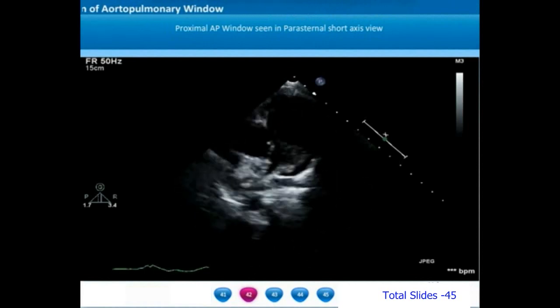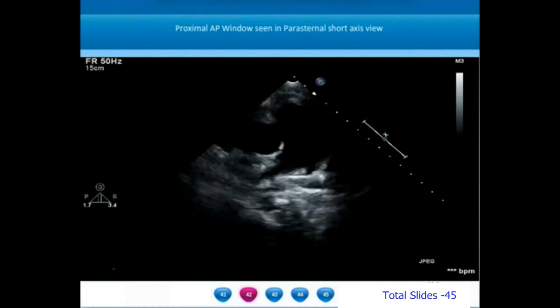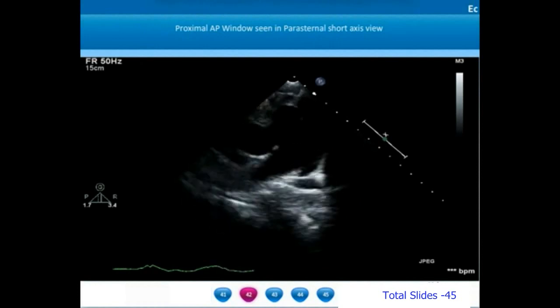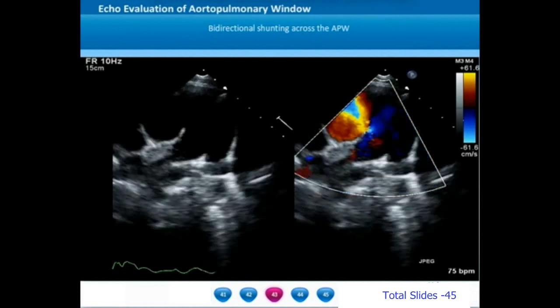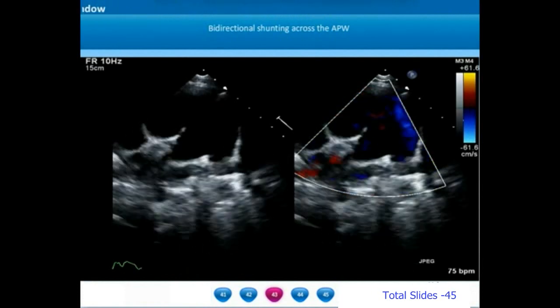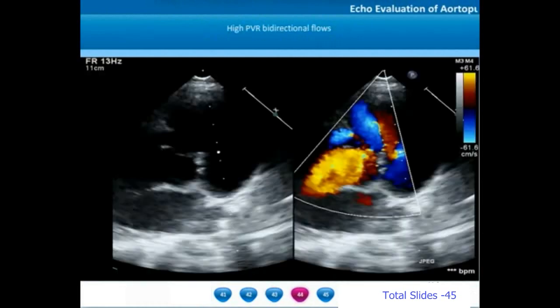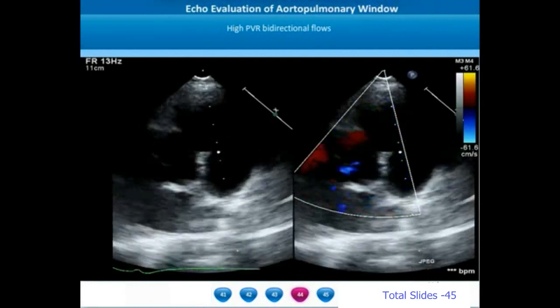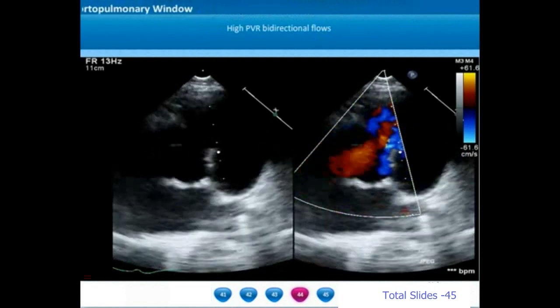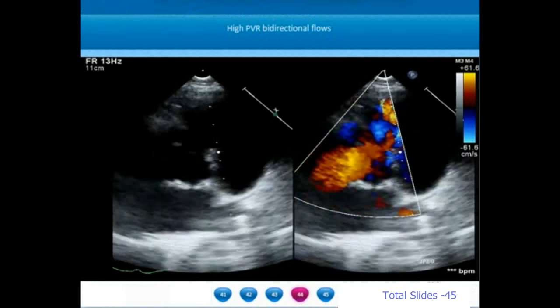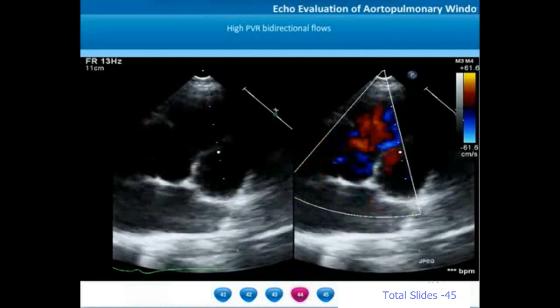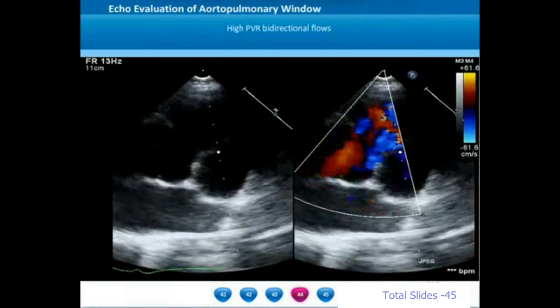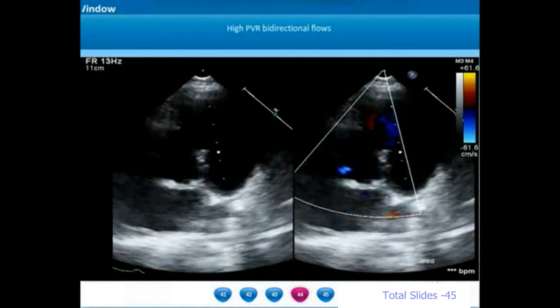However, when we go to a parasternal short axis view, there is a very large proximal AP window not extending up to the PA bifurcation. The aortopulmonary window has almost the same width as the ascending aorta. On color flow interrogation, we notice a bidirectional shunt across the AP window — the pressures in the ascending aorta and pulmonary artery are similar. We hardly see a substantial left-to-right flow, and the aortic valve is seen in close proximity to this aortopulmonary window. This is a proximal aortopulmonary window with markedly elevated pulmonary vascular resistance — or in other words, a proximal AP window with Eisenmenger syndrome.